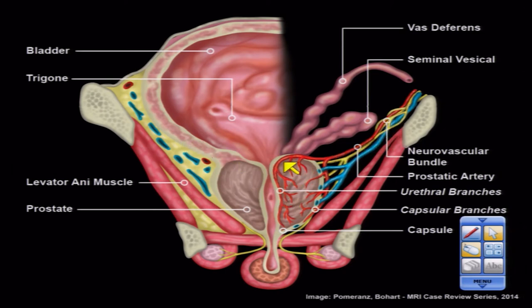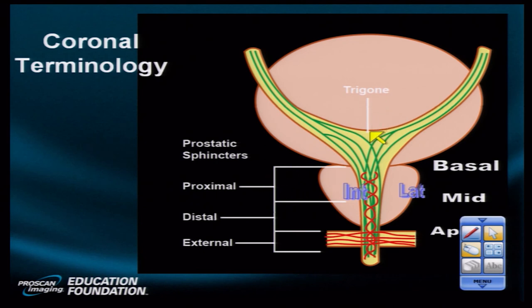Here we are back in the coronal projection showing the neurovascular bundles out to the sides, and the base, apex, and mid portion of the prostate with some vascularity including the urethral branches, which penetrate the prostate. Sometimes you'll actually see small dots in the prostate representing vessels, and sometimes small dots representing prostatic calcifications. These are two features that may completely confuse you when looking at the diffusion maps or ADC maps, as they may show up as darker areas and produce confusion in PI-RADS 2.0 diagnosis.